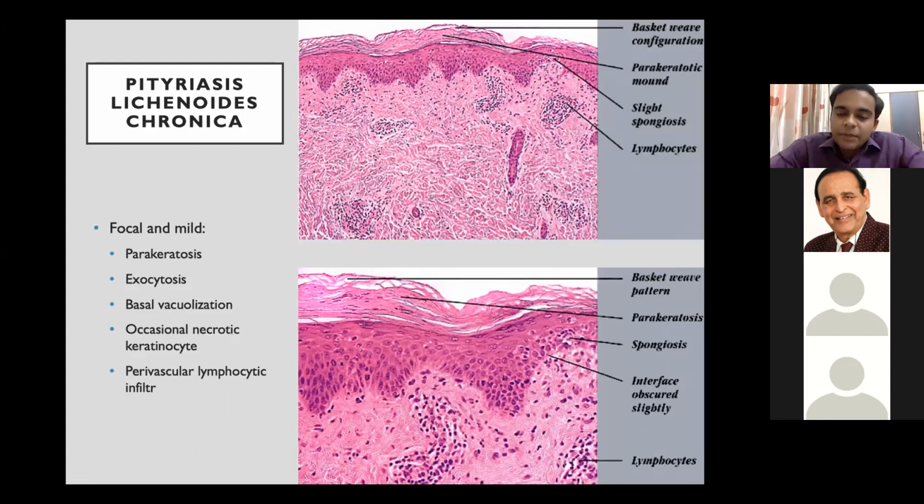So vasculitis is primarily neutrophilic, the classic vasculitis that we know of, but a lymphocytic infiltrate around the vessel slightly damaging it is also called vasculitis. So lymphocytic vasculitis is not so common a tissue reaction.